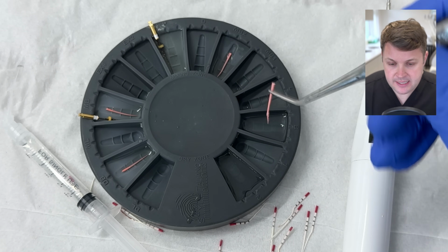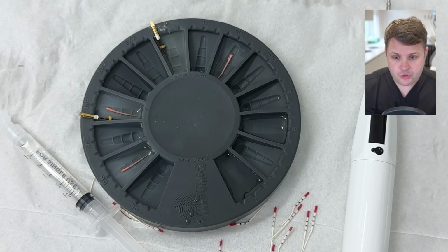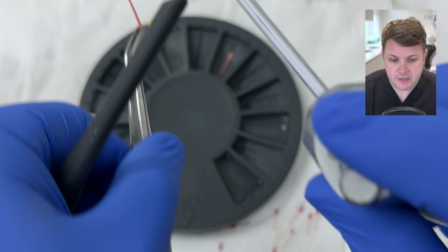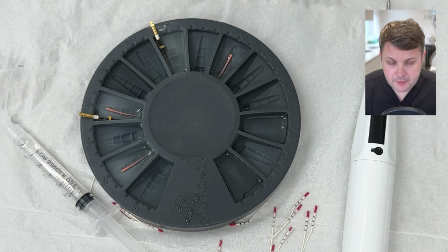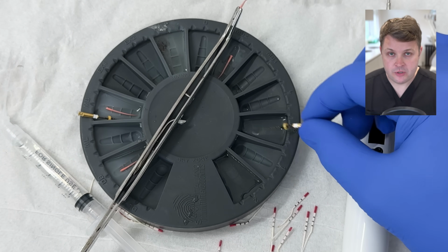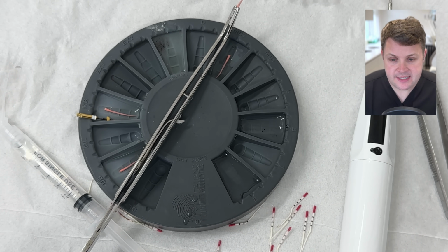I am going to get my cone, dip it into isopropyl alcohol, and just dry the GP cone here, get rid of all the residue, and then place that to one side. I'm going to place my glide path file again into the isopropyl alcohol, make sure that's all nice and dry, and then I am ready to place the sealer.